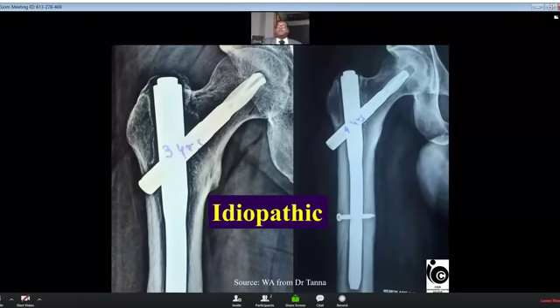This is probably because of differential flexibility of the bone and the implant. So the ideal implant is one which has similar flexibility like a bone, but I don't think any implant in the market is ideal. They are too stiff for a flexible bone. Hence, over the years, some of the implant takes the load and leads to breakage of the implant also.